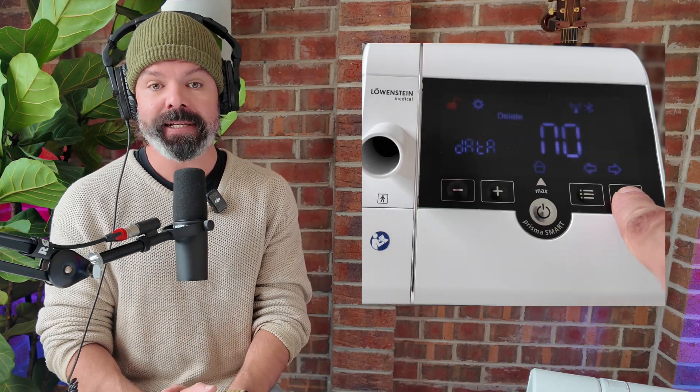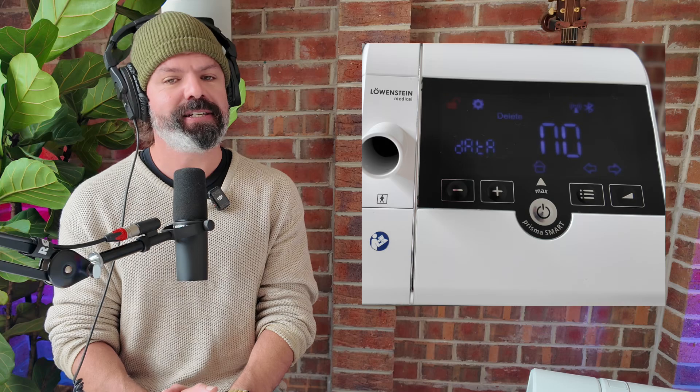Next up is delete data — and you guessed it, that's exactly what it will do. It will format the SD card and erase all stored data, and once it's gone, you can't get it back. So make sure that you upload your therapy data to Sleep HQ so you always have a backup, or you can copy your SD card to your computer, upload it to Google Drive, whatever you want. It's always good to have a backup of your therapy data just in case.